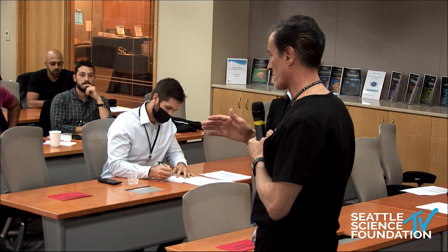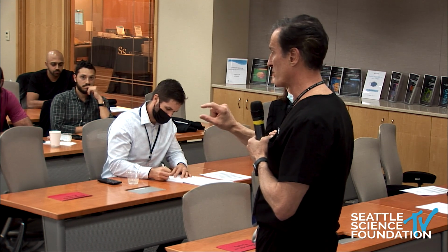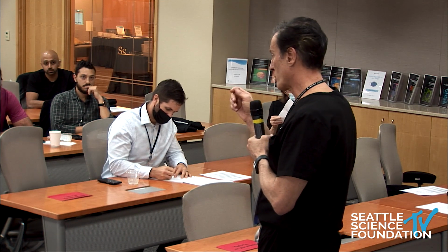Doug, repeat the question. So the question is when do you choose to do transpedicular versus another approach, right? So transpedicular is usually a bilateral approach. So the spine jack is placed transpedicular. That's how it's designed to be placed. As you can see, the working channel didn't go into the posterior portion of the vertebral body. It kind of hung out in the pedicle. So if you don't go transpedicular, it's going to be loose. And you have to hold the working channel to put the implant in, which is okay, but it makes it more difficult.